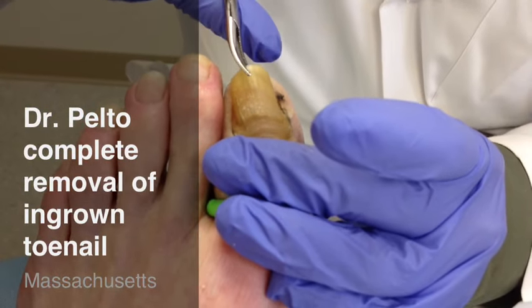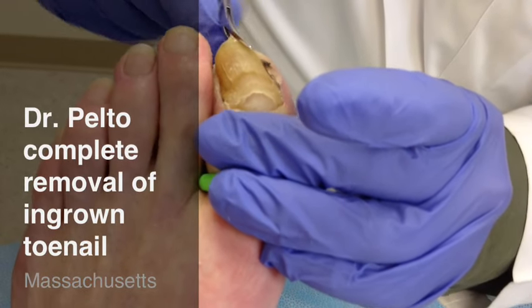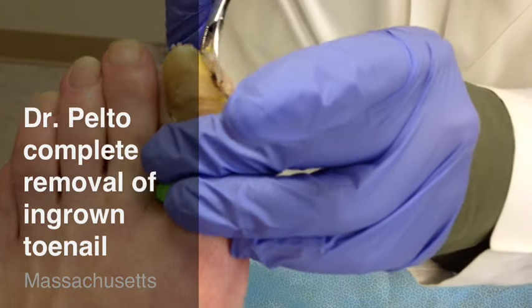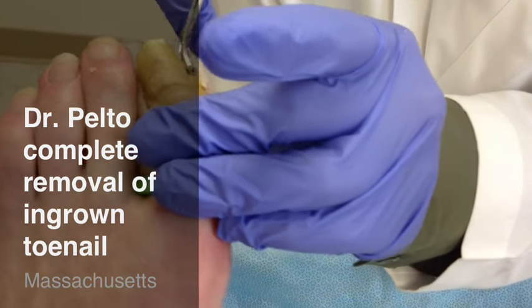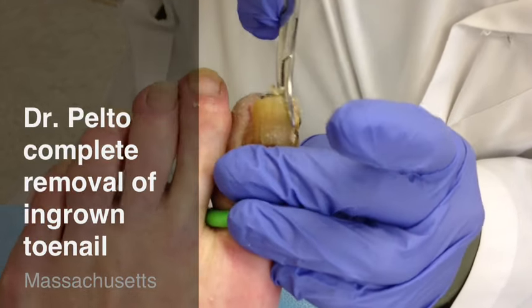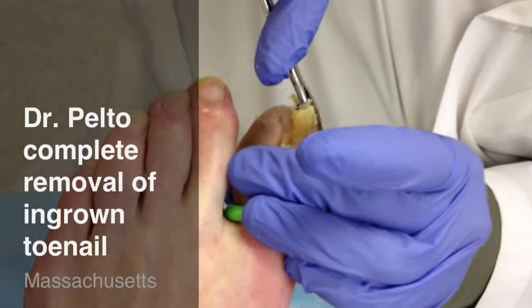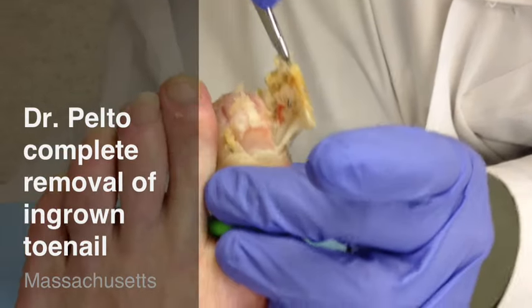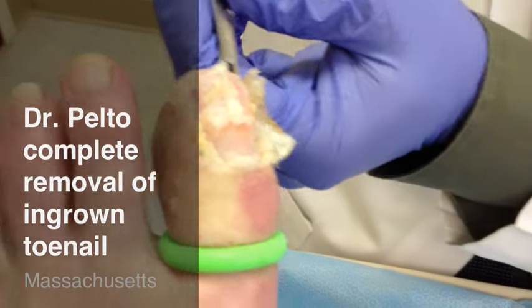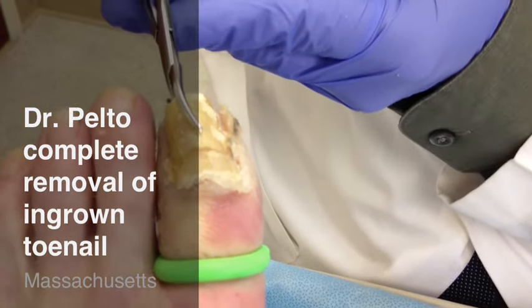It's quite easy. You take a hemostat, you put it underneath the nail, and you just pull or twist. And there it kind of comes off. You see how it was kind of in the edge there, kind of like that.